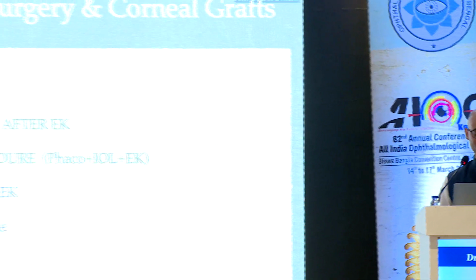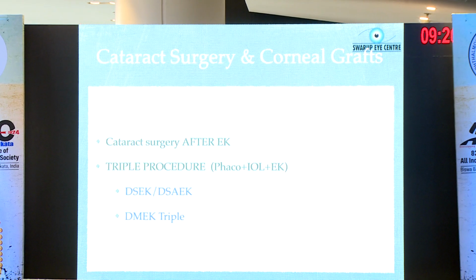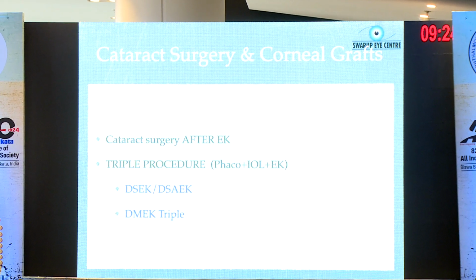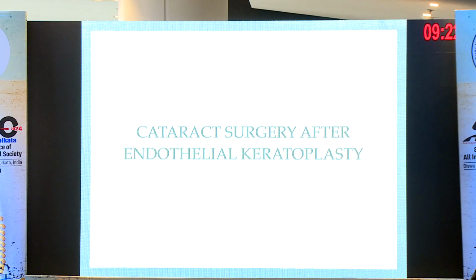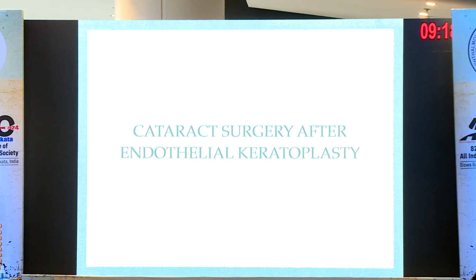When you're talking about a combination of a cataract surgery with endothelial graft, that is called an EK triple, and that could be a combination with either a DSEK or a DMEK. The first situation is cataract surgery after an endothelial keratoplasty. So either the patient has had a DSEK or a DMEK.